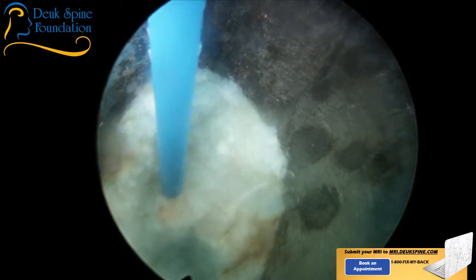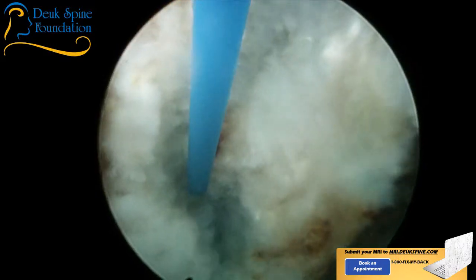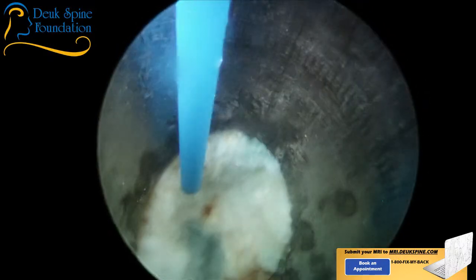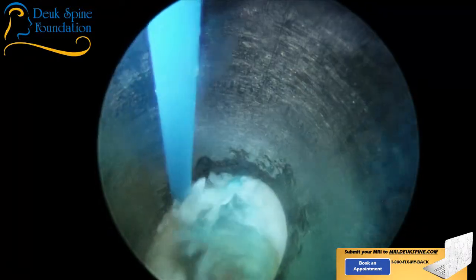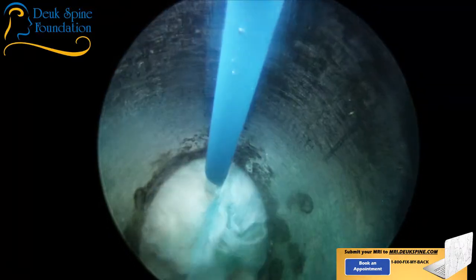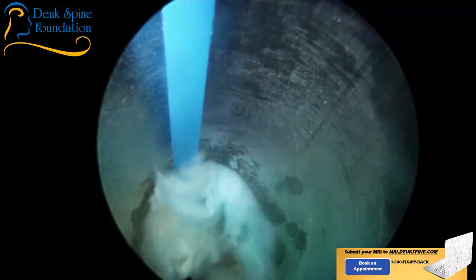We are inside the annular tear, and we are at L4-5, I believe, correct? Next we'll do L5-S1. Now, I've cleaned what I needed to here. I'm going to start backing my tube out, and that blue right there shows you where the tear is. The white is the annulus, and that blue is where the annulus is torn.